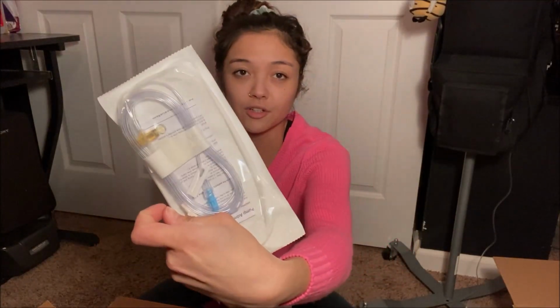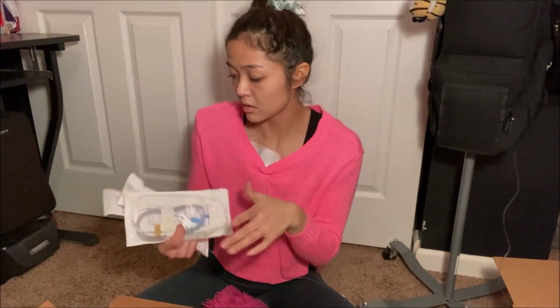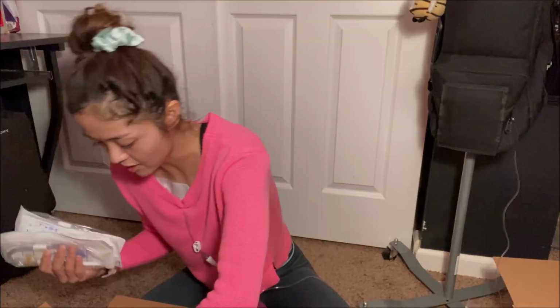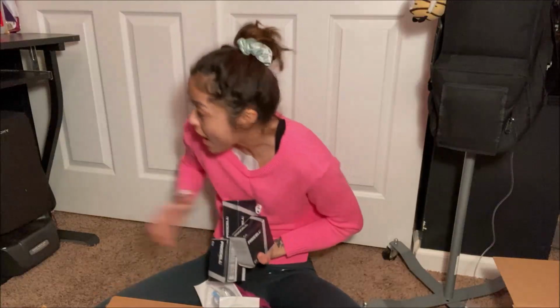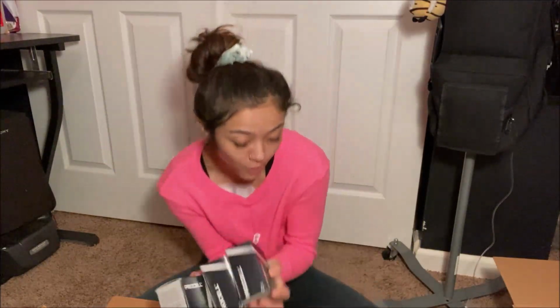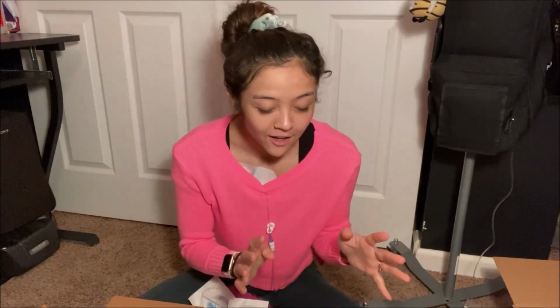And then these are just extra, or not extra, but they're the line for my infusion. There's one per infusion bag, of course, because you have to replace these with each infusion. And no, there is no charger for the new pump. There's just more batteries, and I have a ton of batteries, like a crazy amount of batteries. So I wish they would send a charger, but they don't. These need replaced with each infusion that I do.